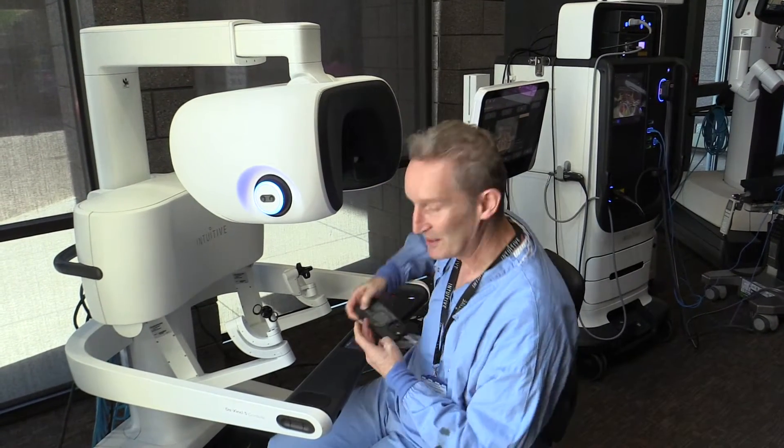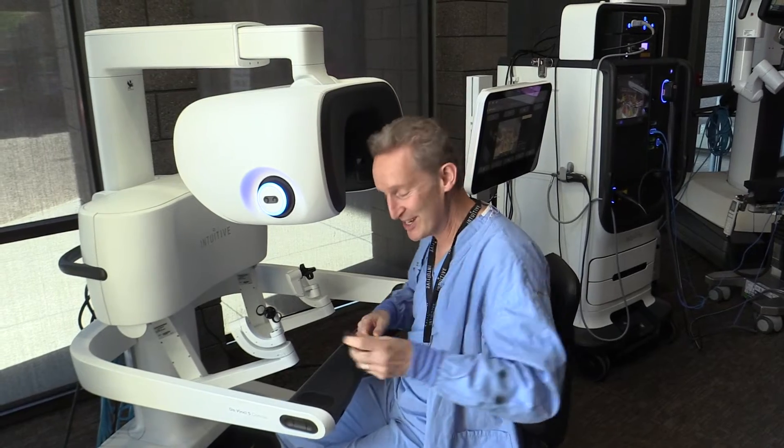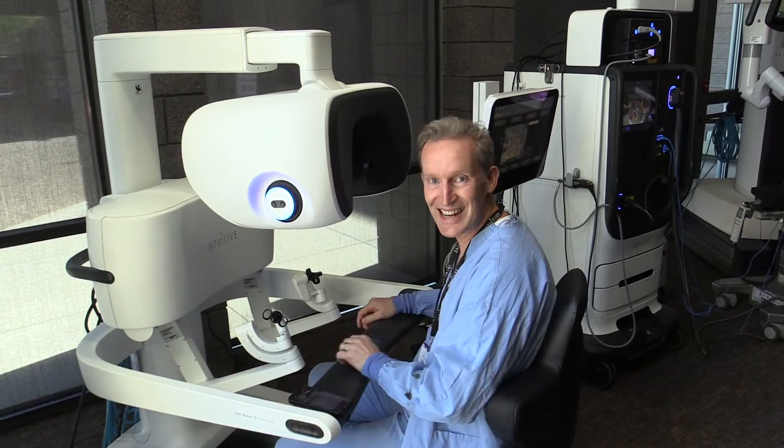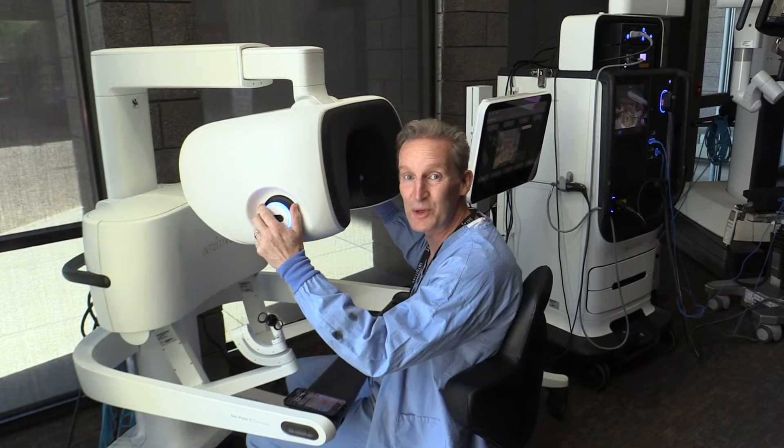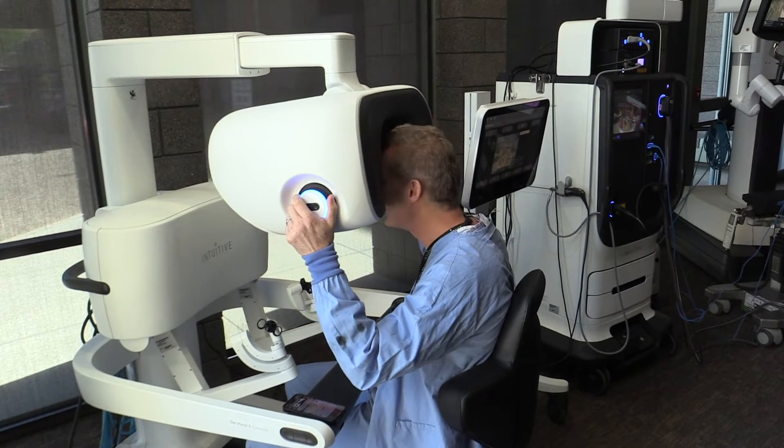Do you know the best thing of all? You can charge your phone while you're on the console. How cool is that? I'm charging my phone. I'm off to do an hour of practice with my force feedback — I'm going to have a feel. Just hit my leg.